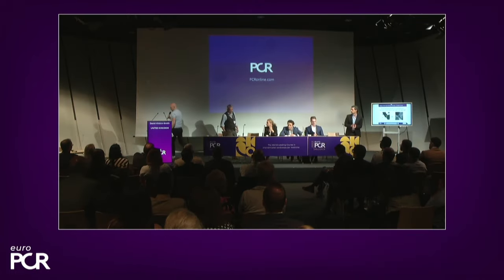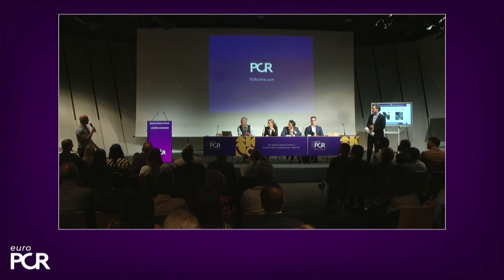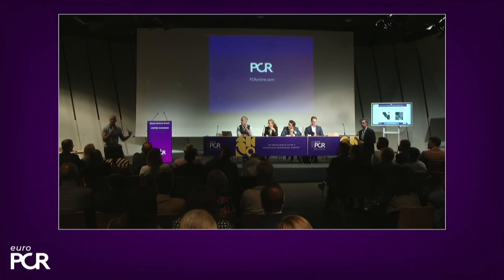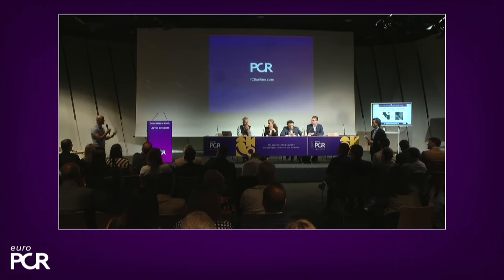Excellent, Dave. From the chat, there are some questions related to calcium. We'll cover that in the next presentation in a second. But basically, prosthesis patient mismatch is an important item that was discussed in Dave's talk. And I have the impression that the surgical community is getting more and more sensitive to it. And we also see that in randomized controlled trials. If you look at the high-risk patients' studies and compare them to the lower risk, surgeons have been implanting larger valves. So the question to you, Sabine, is it true that prosthesis patient mismatch is an item in the surgical community, and are surgeons getting more sensitive to this and aiming for bigger valves and considering, for instance, root enlargement?